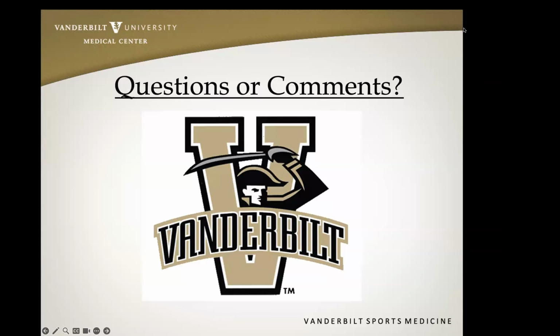We all want to just go straight to the medial gastroc because we think it's that. But you pointed out, one of the things that we sometimes see with these is a plantaris tear. With a plantaris tear, you see that tubular edema and hemorrhage coming through that same region. I think it's really important to identify that, because once again, from a prognostic standpoint, it has an excellent prognosis and a very quick recovery. So evaluating that whole structure, from muscle down to the tendon distally, is really important.